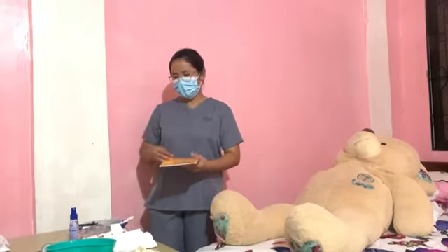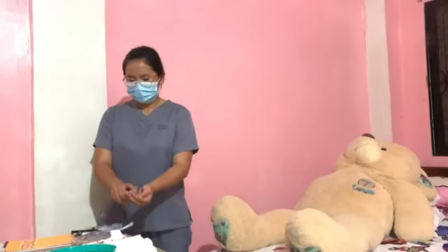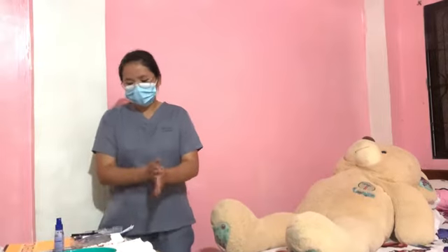We need to verify the order so that we will insert the NG tube to the right patient. So I've already verified it. And then perform hand hygiene and put on PPE if indicated. This is to deter the spread of microorganisms.